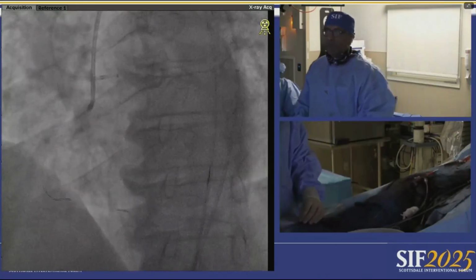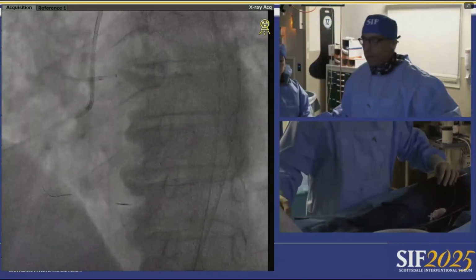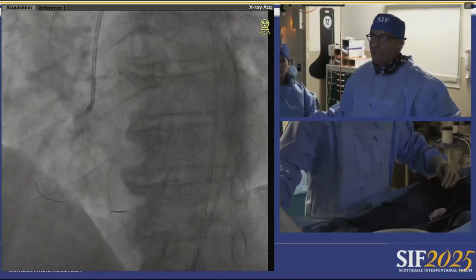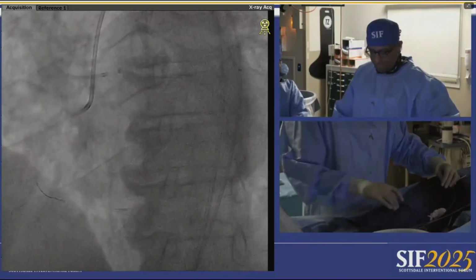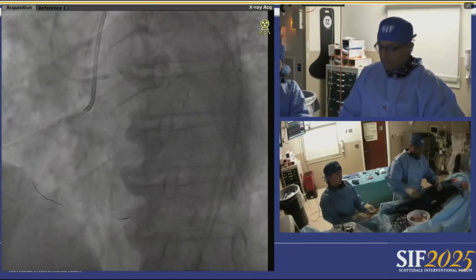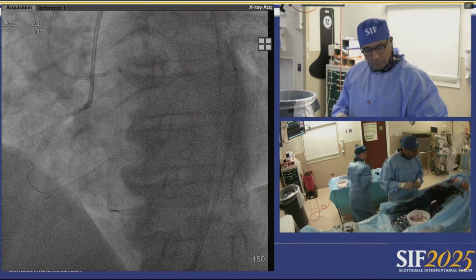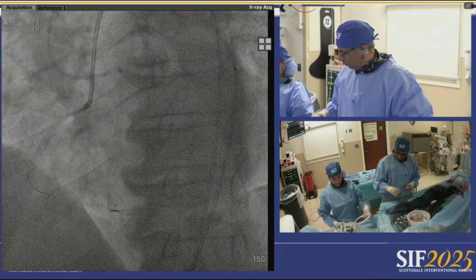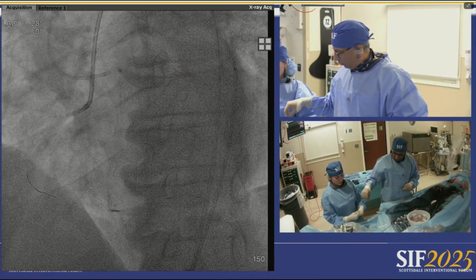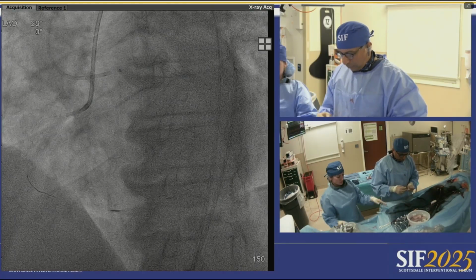And one aspect to that case that we didn't get a chance to talk about is if this is someone who's thinking about getting a valve, you have a lot of additional imaging to help guide how you're going to use that MCS. So you've got TAVR CTs that are going to give you all of the vascular access options. And if you see femorals like that, that could be a case where the chance of hemodynamic instability is great and a bailout strategy is going to be very dangerous. You might consider an upfront alternative access MCS in a case like that as well.